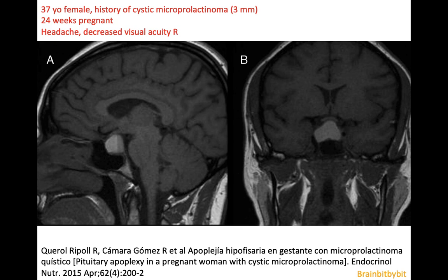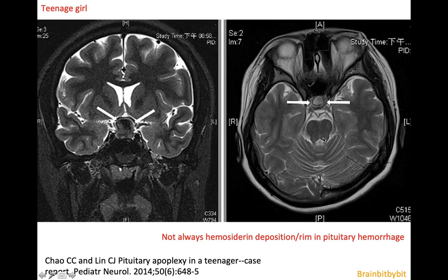In macroadenomas you can also have hemorrhage or hemorrhagic infarction leading to an acute presentation. This is an example of a pregnant 37-year-old female known with a micro prolactinoma who presented at the ER with headache and decreased vision in her right eye. On these T1-weighted images you can see a sellar and suprasellar mass with a fluid-fluid level and displacement of the optic chiasm. It is important to realize that, in contrast to an intraparenchymal cerebral hemorrhage, a hemorrhagic macroadenoma does not always have a hemosiderin rim.